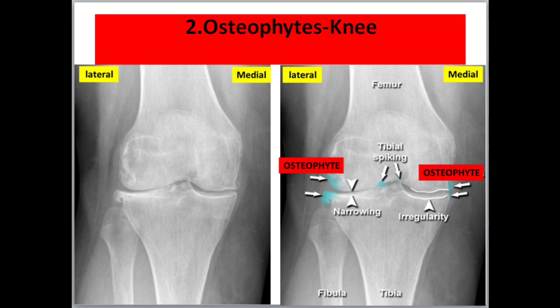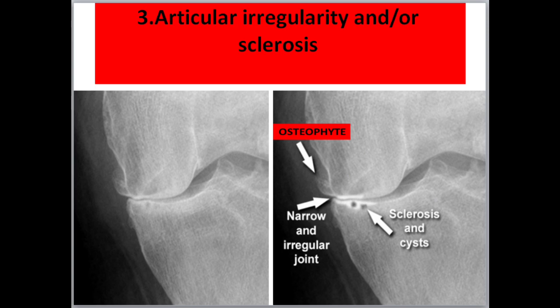Two: osteophytes. Our example here is at the knee, showing the formation of osteophytes — bone spurs — which is a common feature of osteoarthritis. This anteroposterior view of the knee shows osteophytes of the tibia and the femur, and small osteophytes have also formed at the tibial spines, which is called tibial spiking. The knee joint spaces are narrowed and irregular.